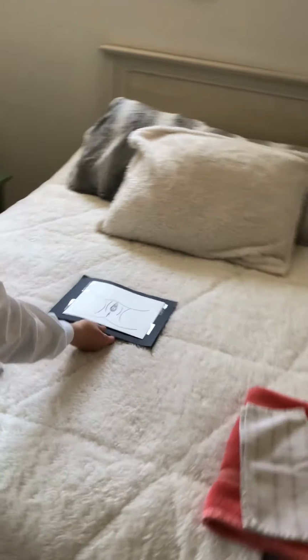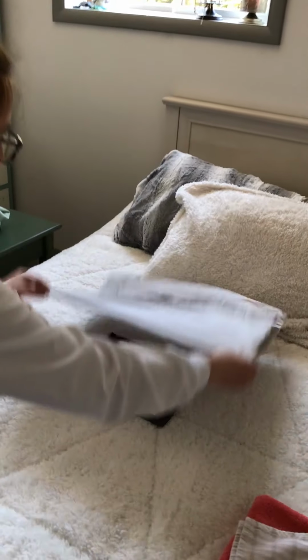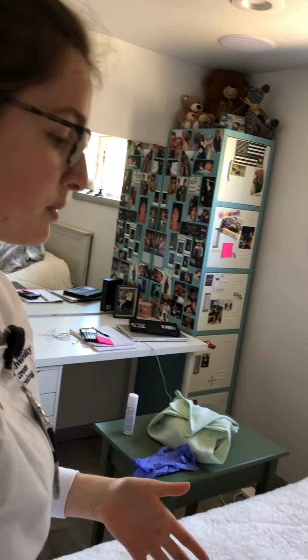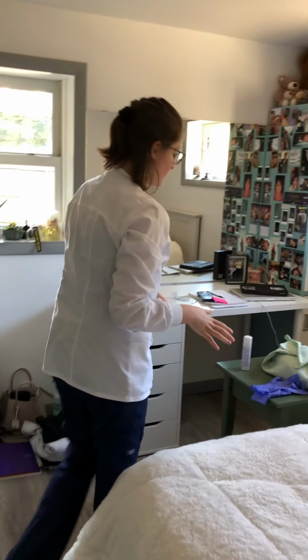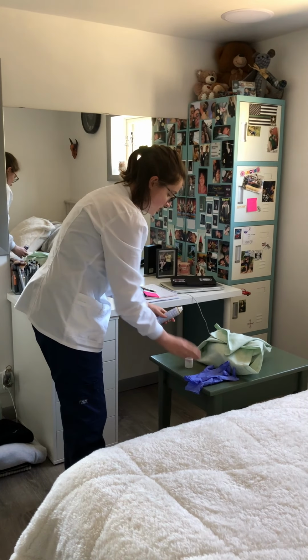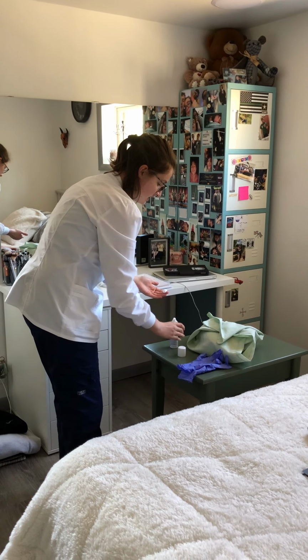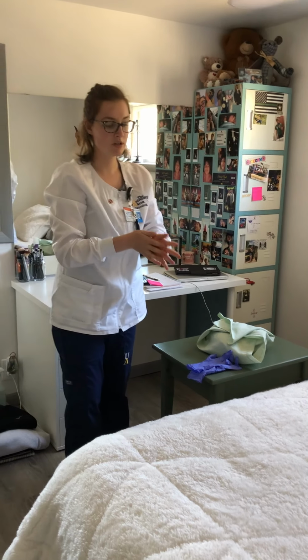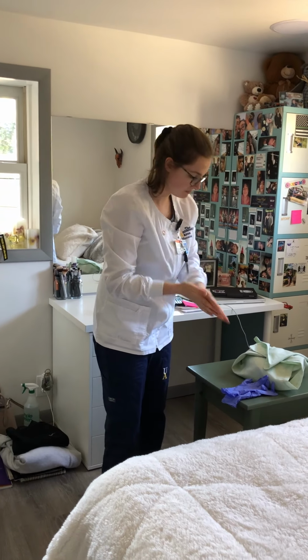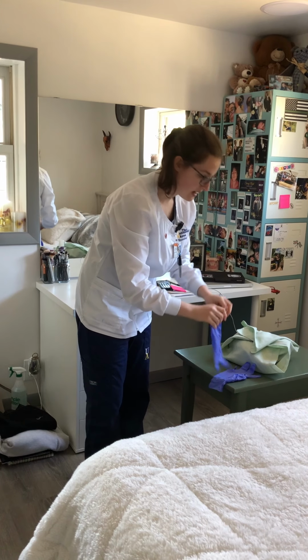So in the real world, the patient would be draped with the gown. So I would go ahead and just explain that I'm going to bring the drape upward and expose the genital region. So I'm just going to go ahead and do that. Okay. And before I do anything else, I am just going to go ahead and use an alcohol-based hand rub. You could wash your hands if you wanted to as well. And then go ahead and don clean gloves.